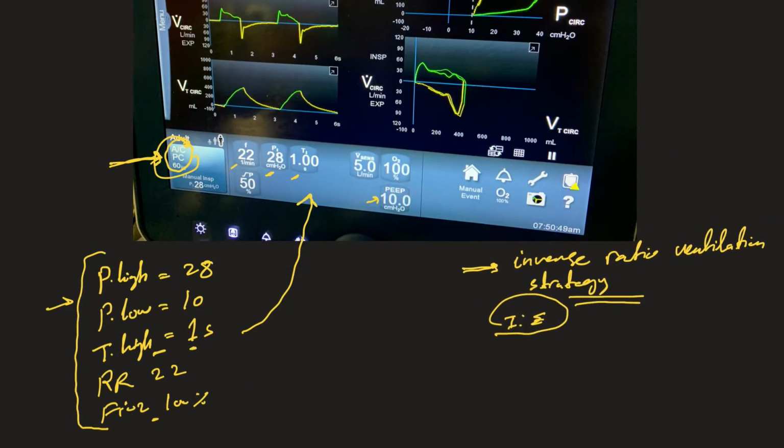It's very important. It's related to the physiology, what happens to the alveoli during the de-recruitment process. To make it clear for you, let me show you some videos and explain exactly what happens at the alveolar level so you understand how APRV can help. First of all, we think of alveoli simply as balloons, and this is not true.